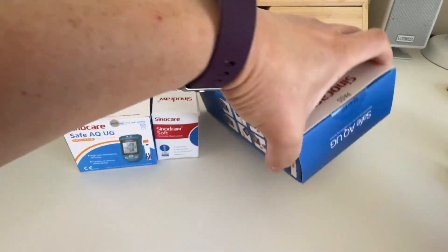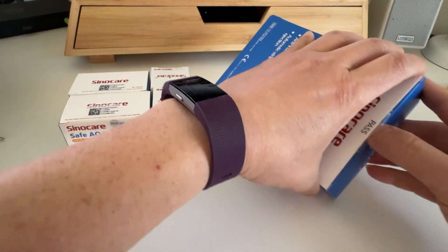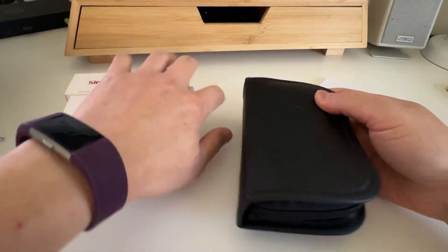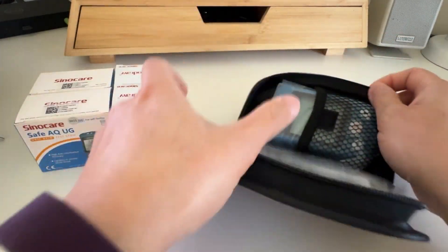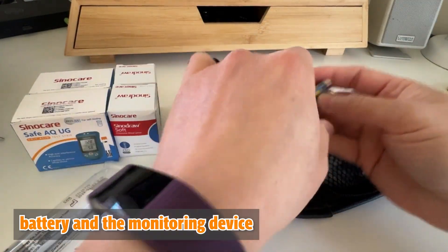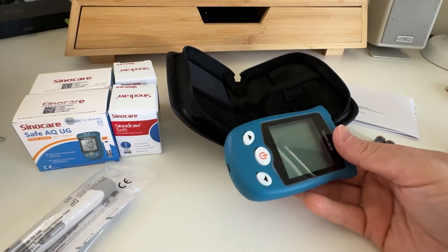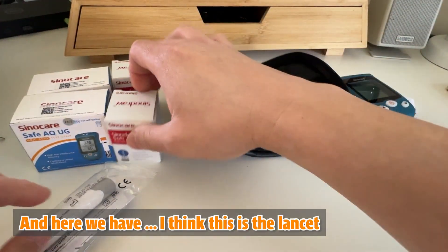The device is all sealed, which is good. It comes with a pouch. Inside the pouch we have the lancing device, battery, and the monitoring device.